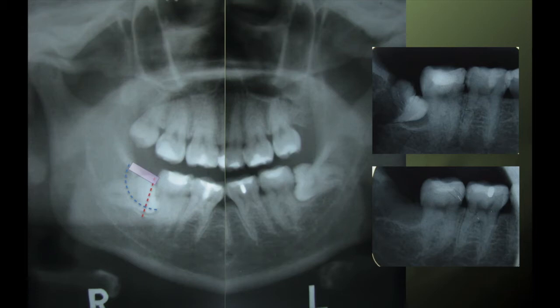A few hours later, the following day, when I looked at the patient, I suddenly saw a portion of a crown seemingly coming out. I took an X-ray, and there I found the small portion of the tooth that I had initially sectioned off. I just flicked it out and confirmed that it had been removed.